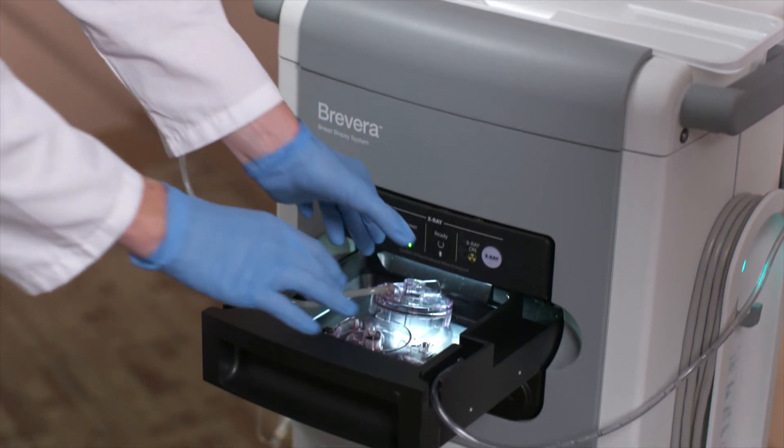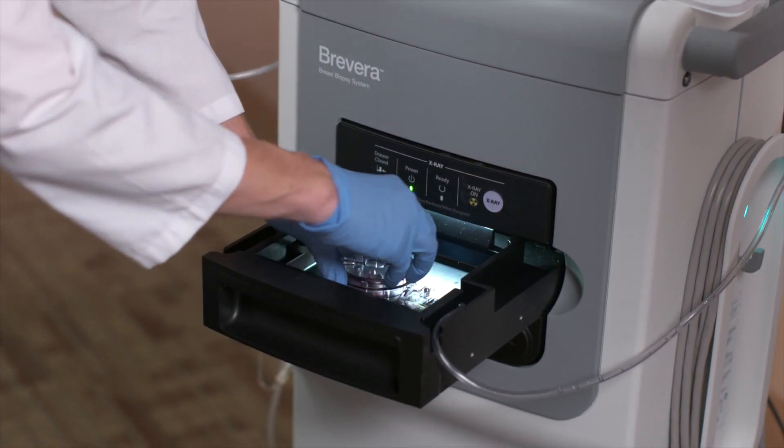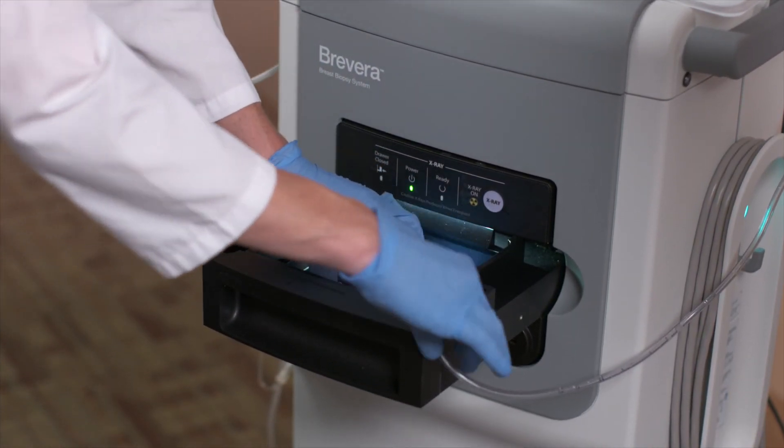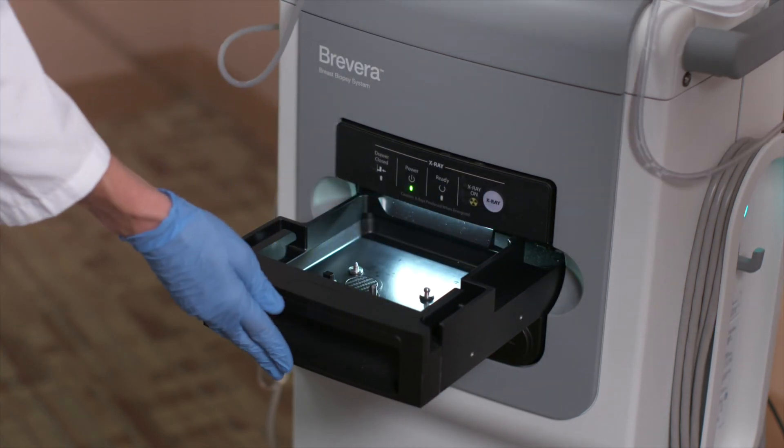After the filter has been retrieved, the technologist will replace the cover of the tissue filter assembly, then remove the tissue filter from the drawer.